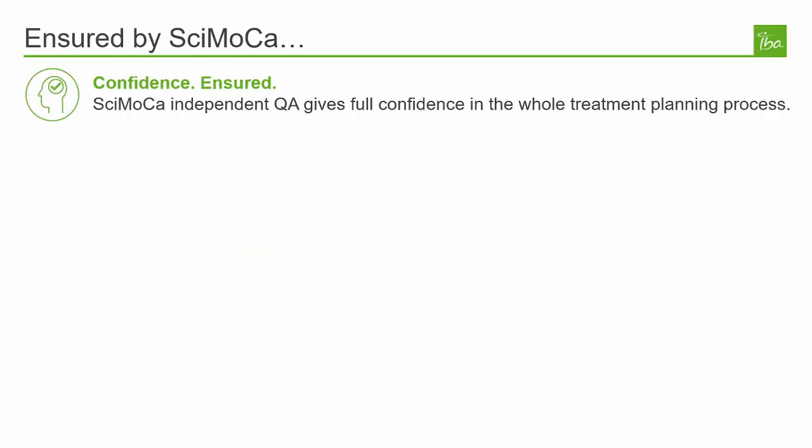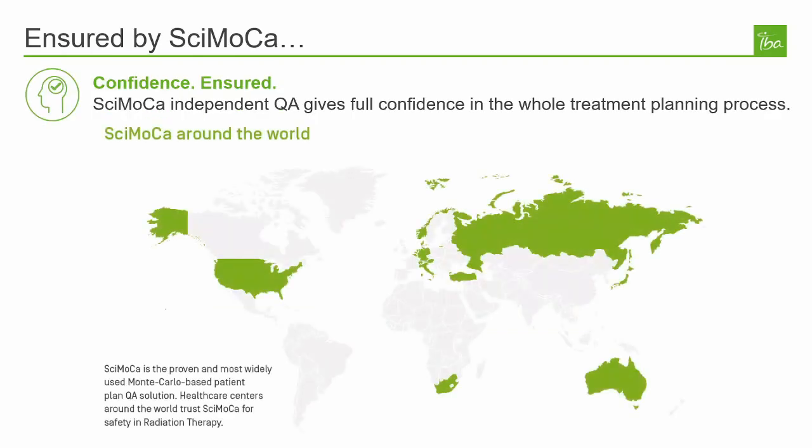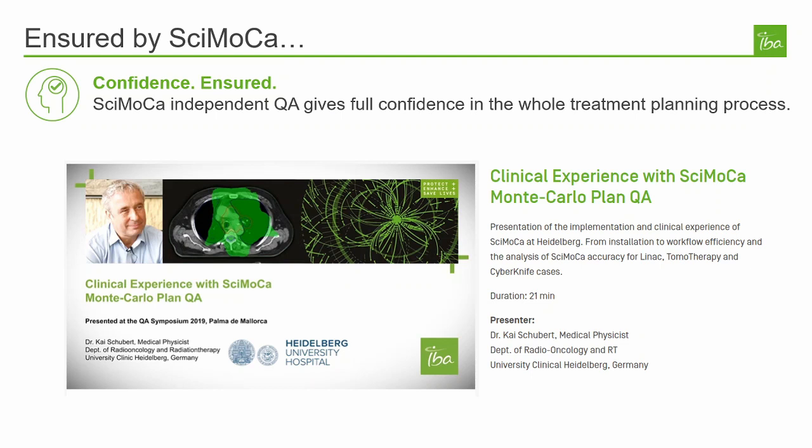On the topic of implementation, this map shows you the countries where SciMoCa can be found in use clinically. If you are interested in hearing more about SciMoCa directly from other users, then I'd like to mention a presentation by Dr. Kai Schubert, a medical physicist at the University Clinic in Heidelberg, Germany. In his 21-minute presentation, Dr. Schubert will discuss his implementation and clinical experiences with SciMoCa for LINAC, tomotherapy, and CyberKnife cases.